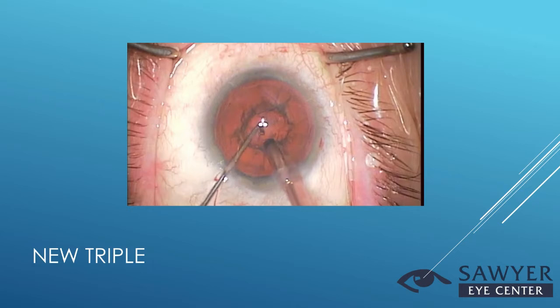And now I'm putting in the DMEK, the endothelial keratoplasty. I'm injecting this through a 2.4 millimeter incision. And once it goes inside the eye, we do not want to touch it anymore, because any touching will lead to more endothelial loss. And obviously we want as much endothelium as possible. I still put a suture in the wound, although I know many surgeons who don't. I've just had things try to come back out at me.